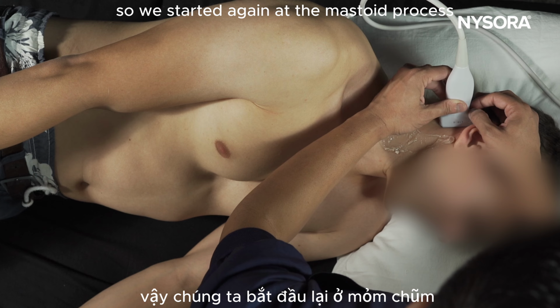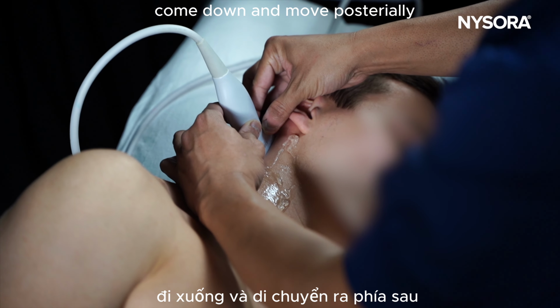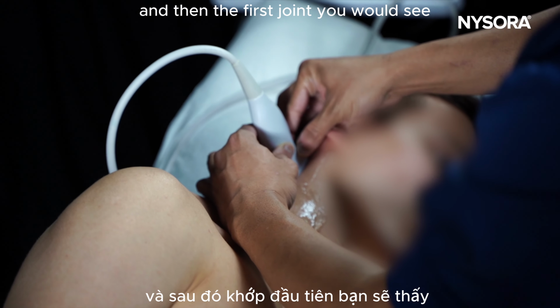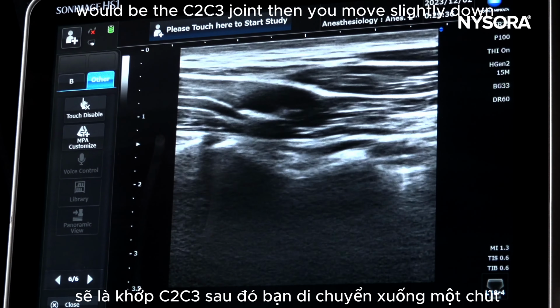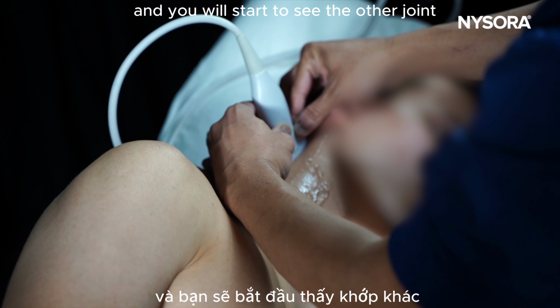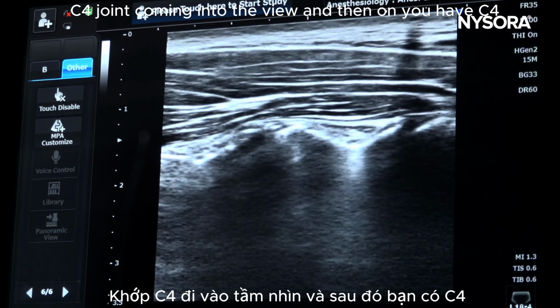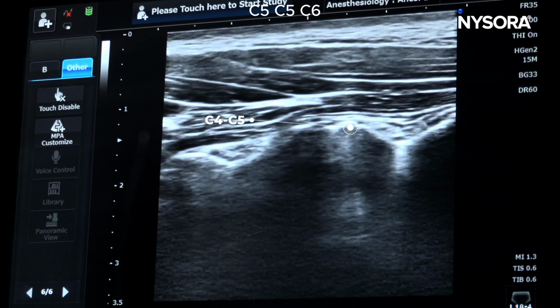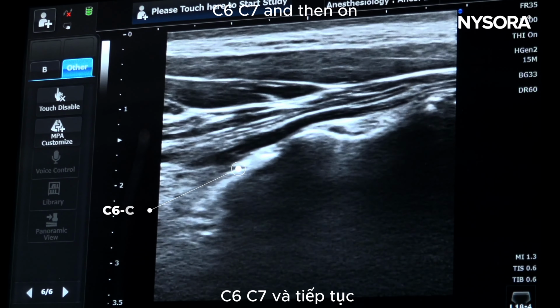So we start again at the mastoid process, come down and move posteriorly, and then the first joint you would see would be the C2-C3 joint. Then you move slightly down and you will start to see the other joint, the C3-C4 joint, coming into view, and then on you have C4-C5, C5-C6, C6-C7, and so on.